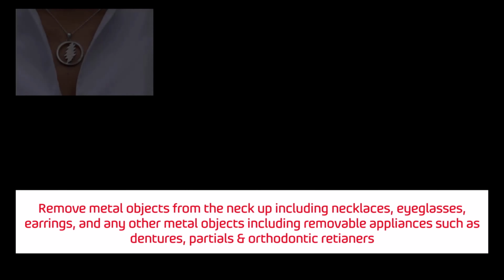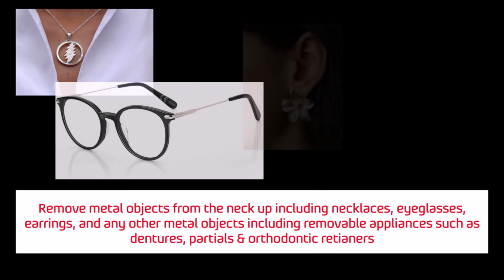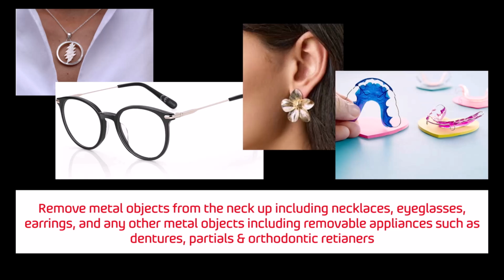In preparation, have the patient remove all metal objects from the neck up, including necklaces, eyeglasses, earrings, and any other metal objects. Smart Plus 2D Panoramic Capture.